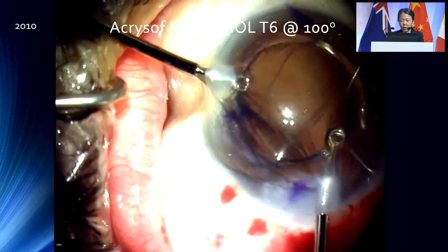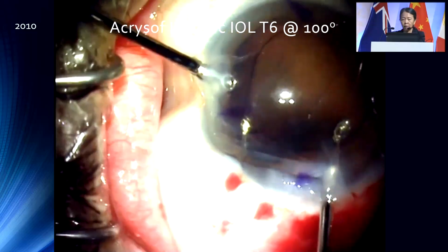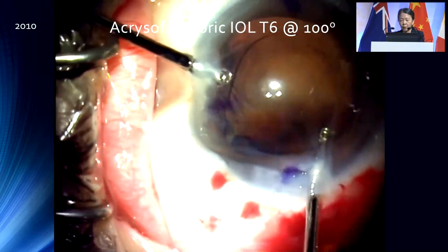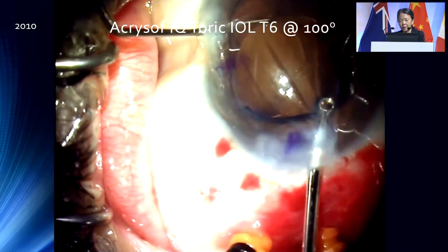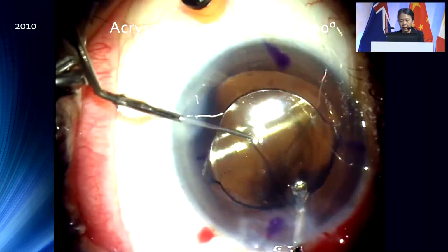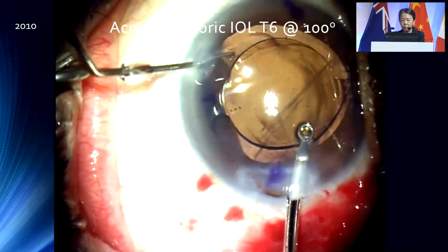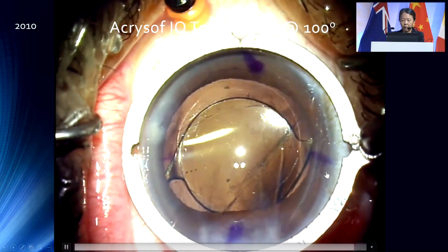So I said, I'm going to try something new. And you can see here I've written that 2010, that's how long ago it was, okay? And so I think this is probably one of the few cases that were being done on toric lenses that had a PCR like this with a drop fragment. I looked at the alignment, no, it wasn't good, so I redid it, but you can see I'm using lens grasping forceps that don't permanently mark the optic.